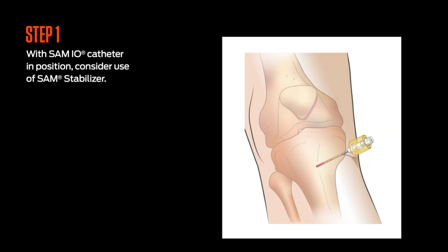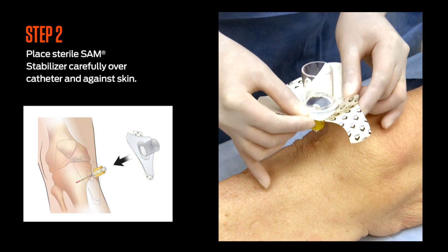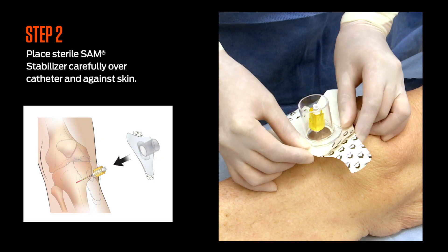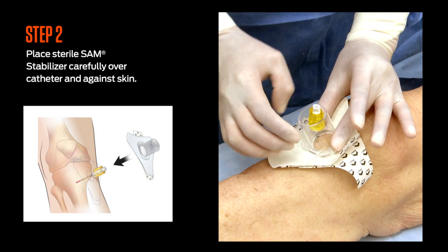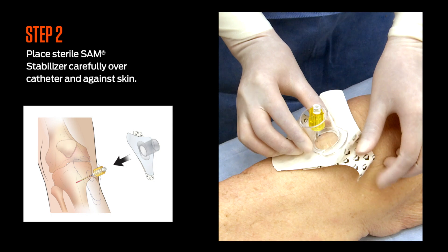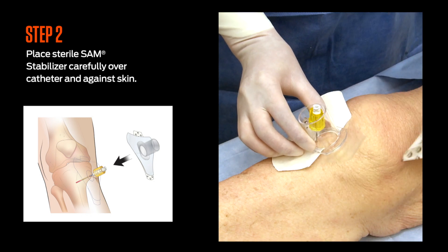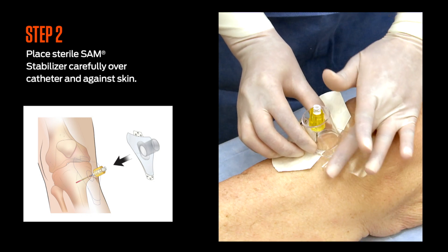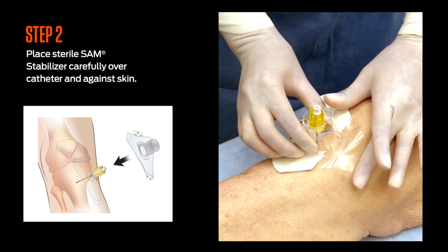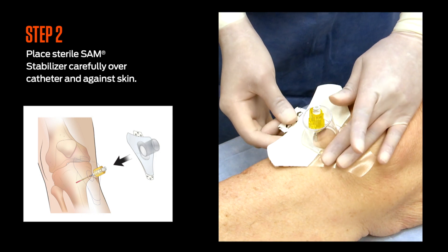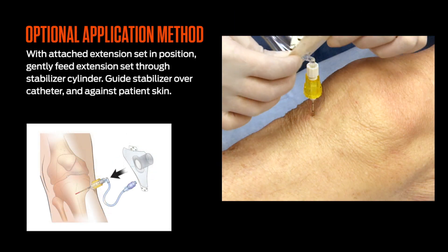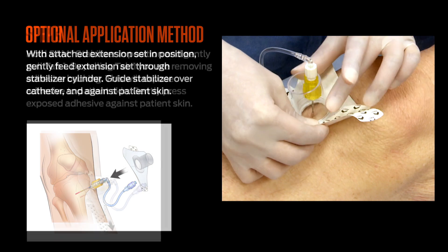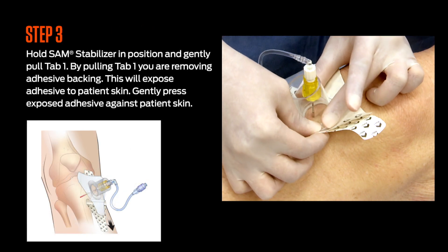The following is supplemental material. With the IO catheter in position, consider using the SAM stabilizer. There are two methods to attach it: place the SAM stabilizer carefully over the catheter and against the skin, then attach the primed extension set to the SAM-IO catheter; or alternatively, attach the extension set first and then apply the SAM stabilizer.